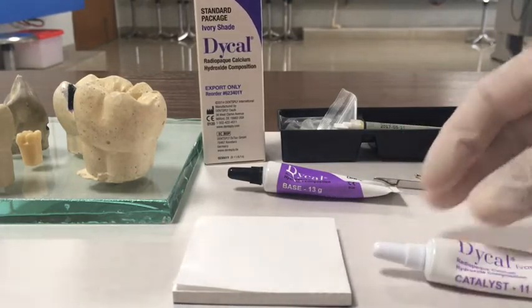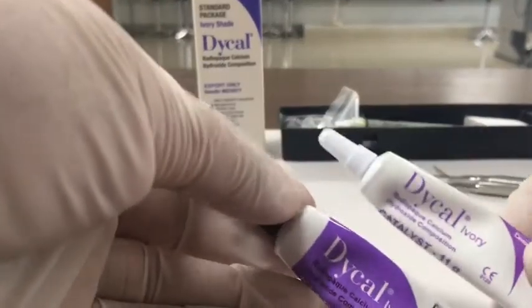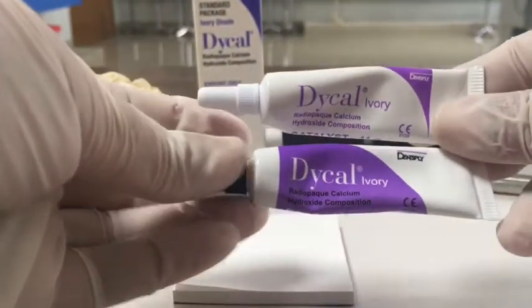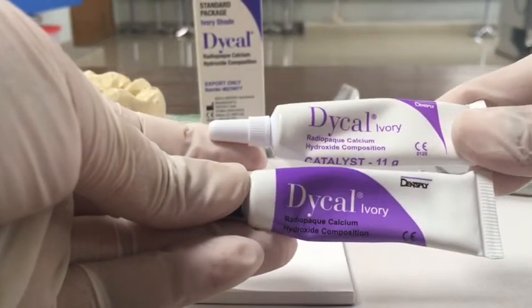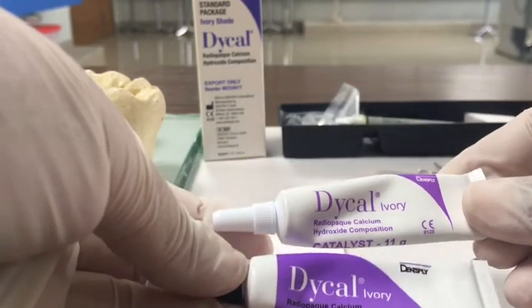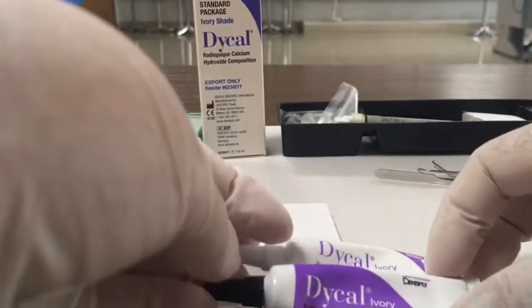Now here we have calcium hydroxide cement which is supplied in a two-paste form. One is the base and the other is the catalyst, and we are going to mix the two pastes together on a mixing pad to get our calcium hydroxide cement. The calcium hydroxide that we are using is the setting type, which is used as a liner beneath restorations.